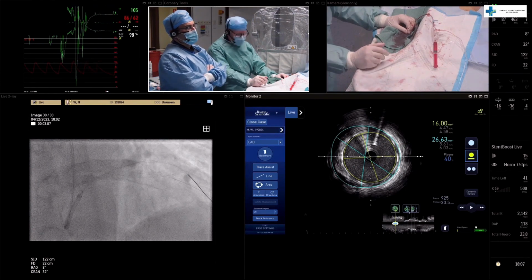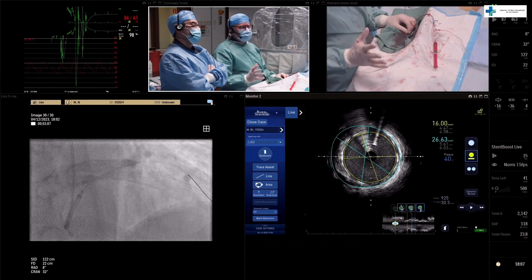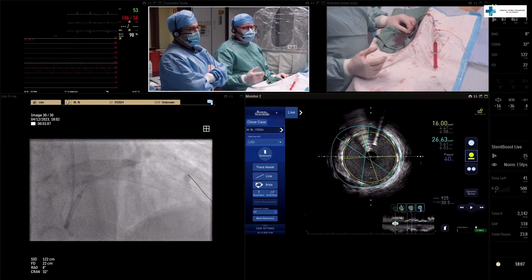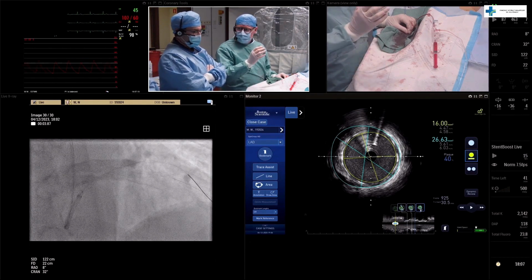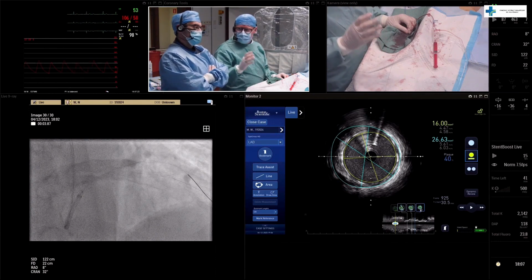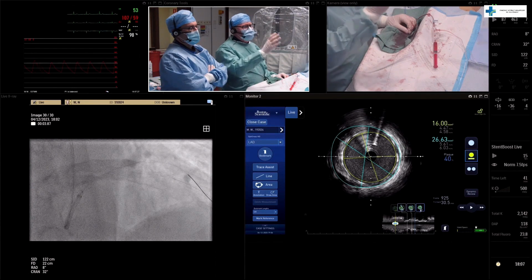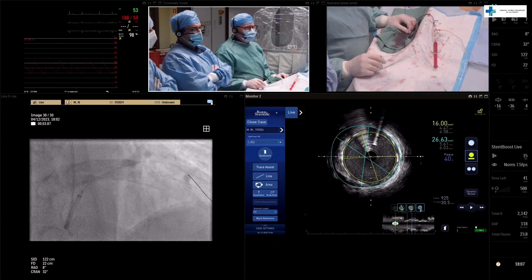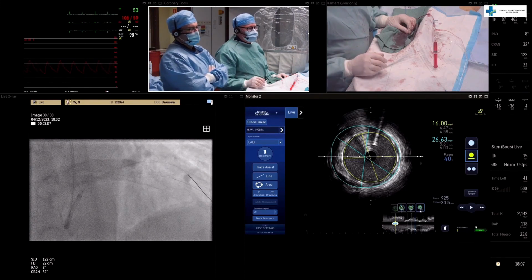So of course, if you count here stent expansion in the left main is 70%, we would be happy to achieve more than 80, optimally more than 90. But usually left main itself is the tapered vessel. So the diameter of the left main in proximal part is bigger even in normal artery. So I believe that we can accept this result as a good one. We did high pressure post-dilatation with 4.5 balloon. And we also corrected the stent distortion.